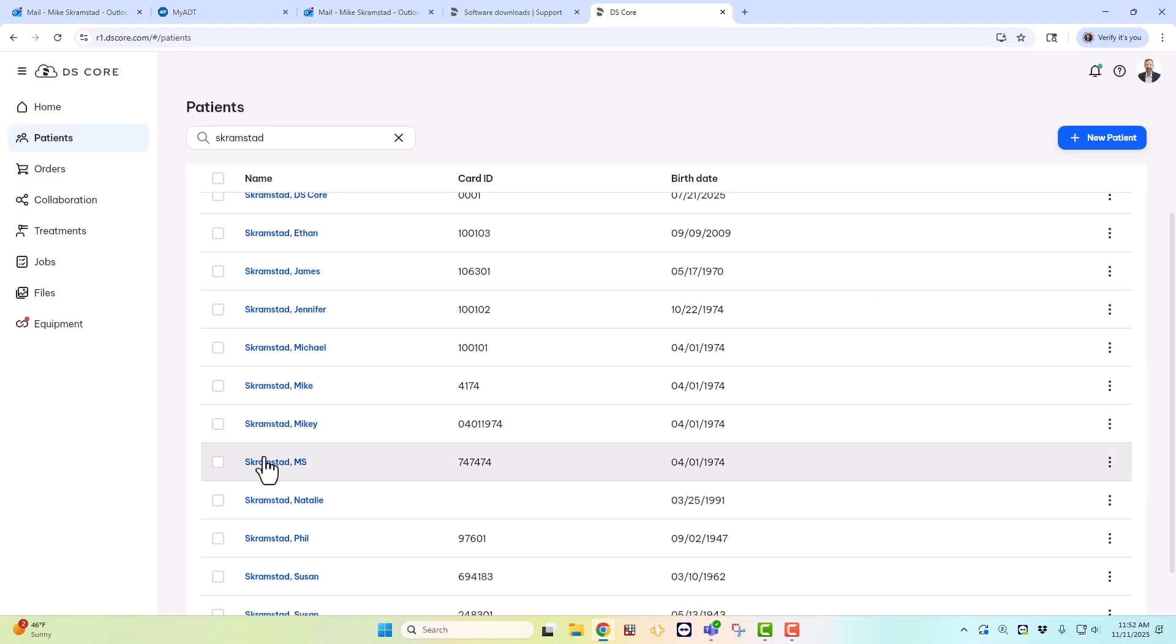And now you see I have the patient added into DS-Core at this point. So it's really doing the same thing that you've always done, you're just doing it in a different place. Instead of doing it in the CEREC or Connect software, you're now going to do it within DS-Core.